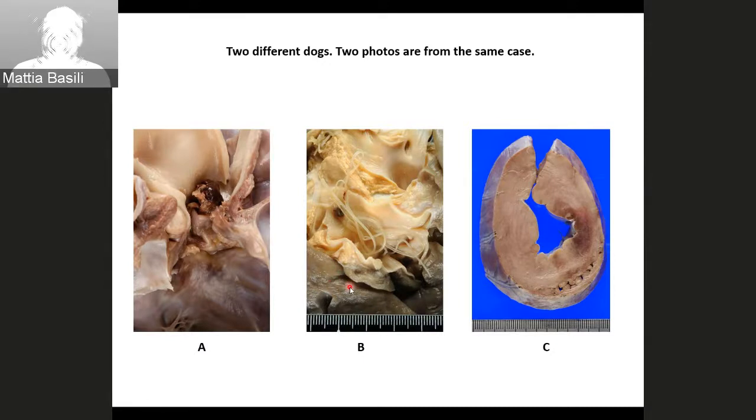Yeah, and then we do have, let's say, a proliferative appearance of the inner face of the endothelium of the pulmonary artery. That looks nodular, irregular. Granular, maybe better. Granular appearance, yeah. Irregular, small, with inflammation.